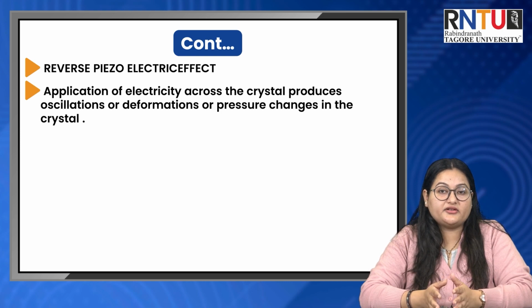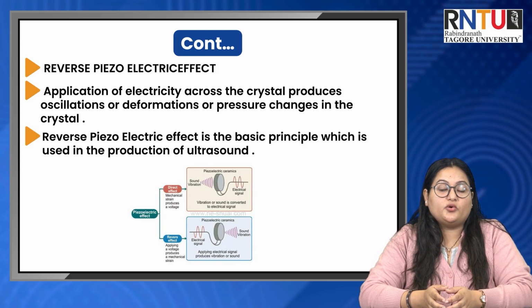There is another effect called the reverse piezoelectric effect. Application of electricity across the crystal produces oscillation or deformation or pressure changes in the crystals. So, from the ultrasound point of view, the reverse piezoelectric effect is the basic principle which is used in the production of ultrasound.